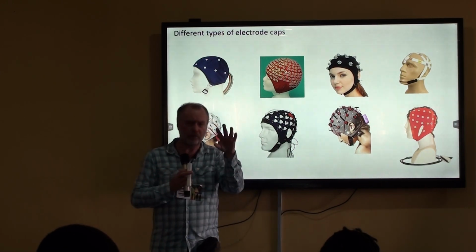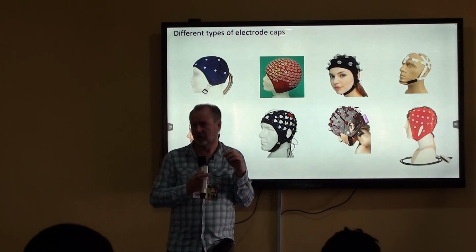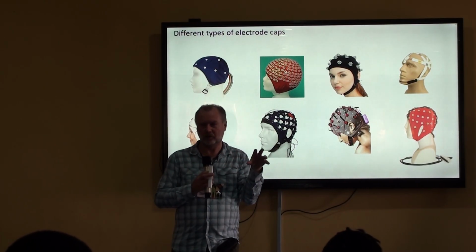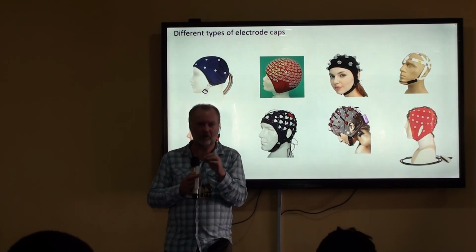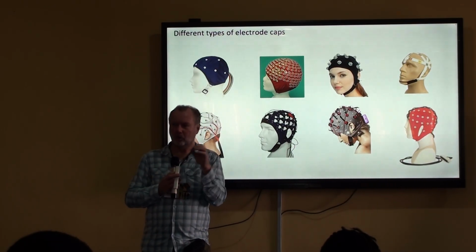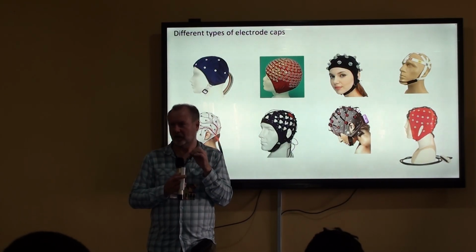If we look at the hardware that I've brought, you will also see that the different hardware systems have made different choices there. What is important is that the ground electrode only helps to reduce the noise. The reference electrode really influences how to interpret the data. So in the pre-processing of EEG data, which we're going to look at tomorrow, we often re-reference. So we often change the reference so that we can interpret the data more cleanly.